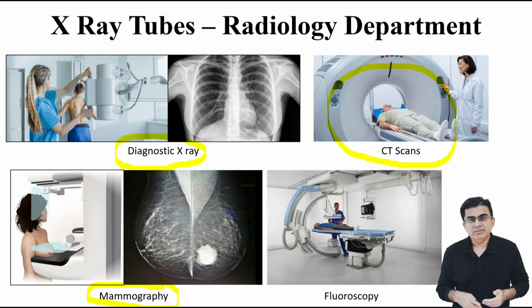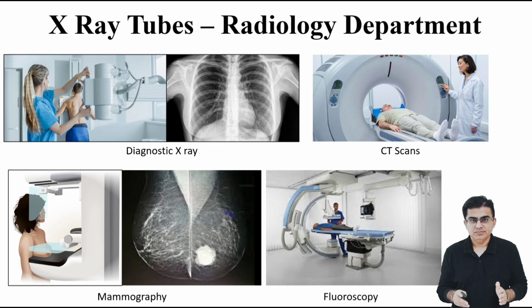You will also see them inside the fluoroscopy machines used in the cath lab and operation theater rooms. They are even inside the portable X-ray units we rush to the ICU or emergency room every now and then. So basically, X-ray tubes are the workhorse of any radiology department. Literally, radiology means X-ray tubes.